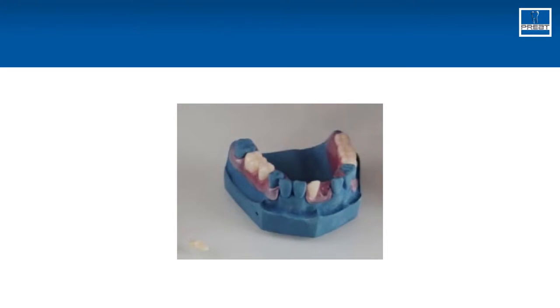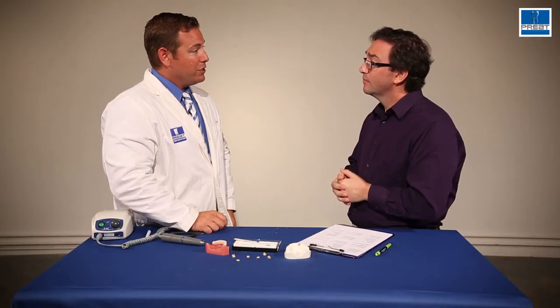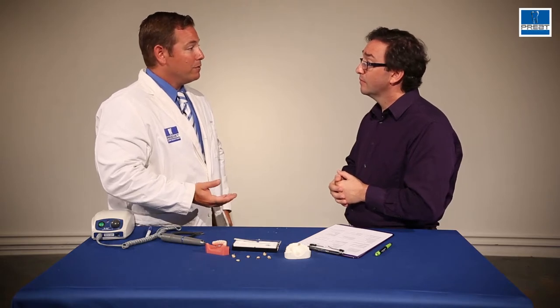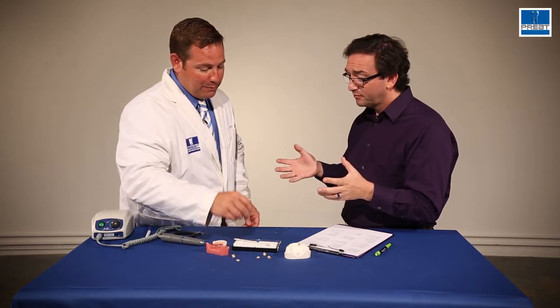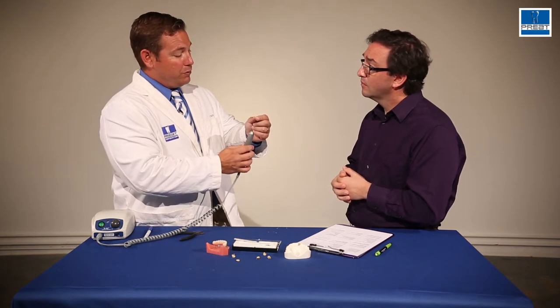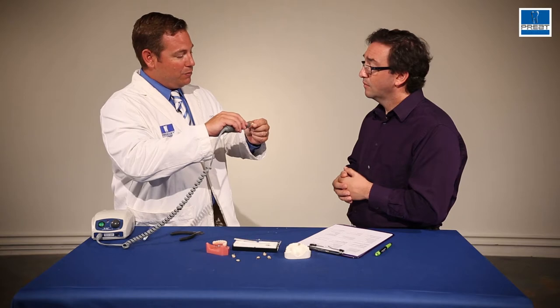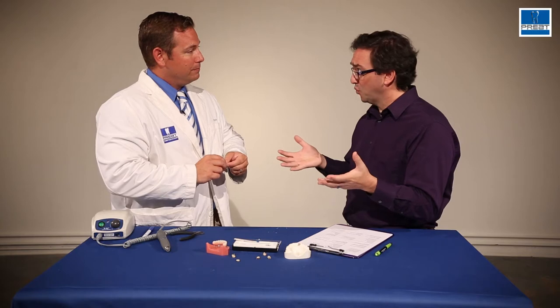I have a couple more questions. Is this particular denture tooth retention system relevant as an add-on to a flexible partial? That's probably one of the biggest applications we see it used for, because repairs and add-ons are so difficult for those systems. If you're going to be using it on a flexible system, you'll be drilling two holes in the tooth — one coming straight up through the lingual surface, and one coming distal. You'll thread two wires in there, and then add your repair material.